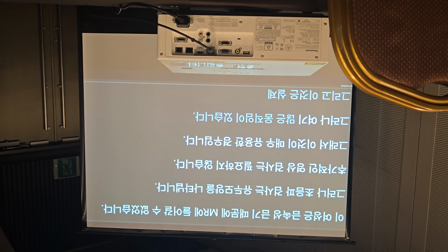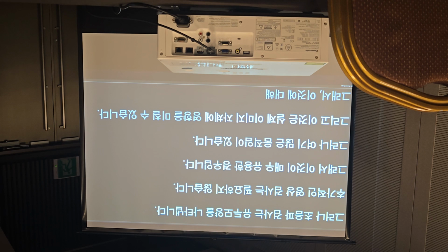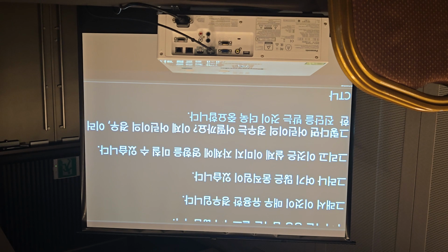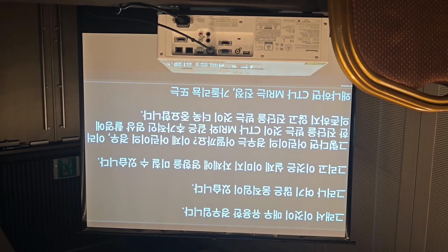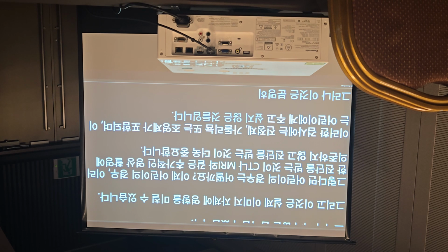So what about in children? Now in children, this is even more important to get the diagnosis without subjecting these children to further imaging with CT or MRI, which involves sedation, gadolinium, or contrast, all of the things that you don't really want to be giving to the children. But this is clearly an FNH with that area of star-like spoke wheel and hyper-enhancement. But again, there's movement here.